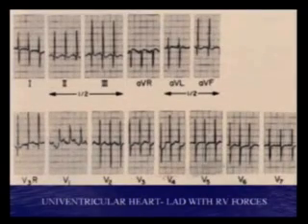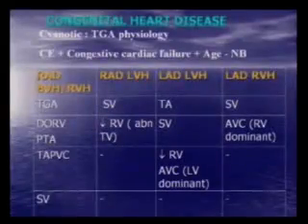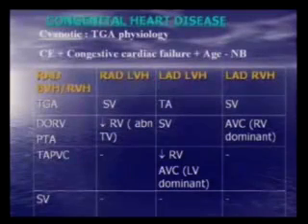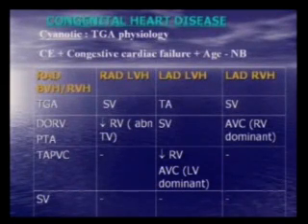That chart which I showed you before has been extremely useful. You can always keep that with you and quickly demarcate the differential diagnosis. Then we come to a group of patients who have increased pulmonary blood flow. If you look at a very strange feature at the top of that line, you will see almost all the patients in those 4 groups have either biventricular hypertrophy or left ventricular hypertrophy, which I showed you before.